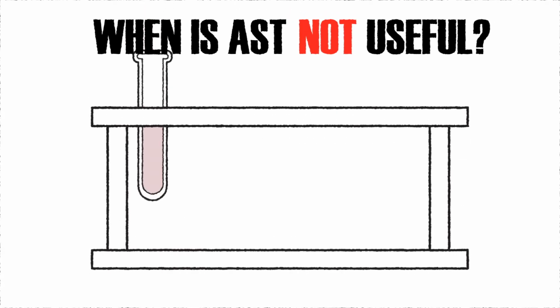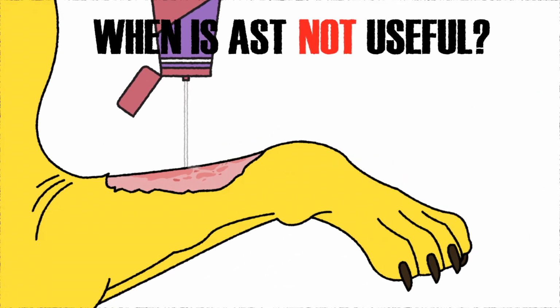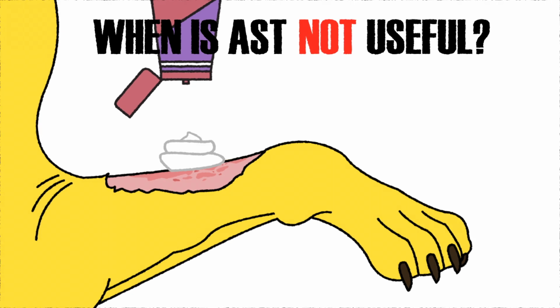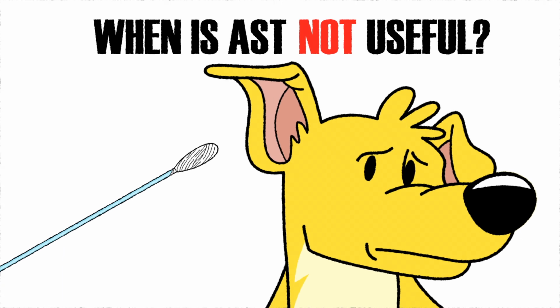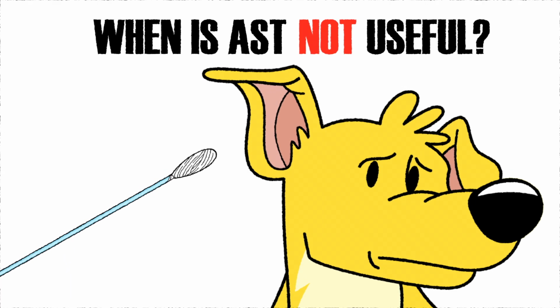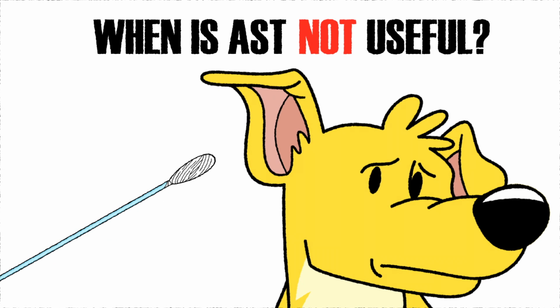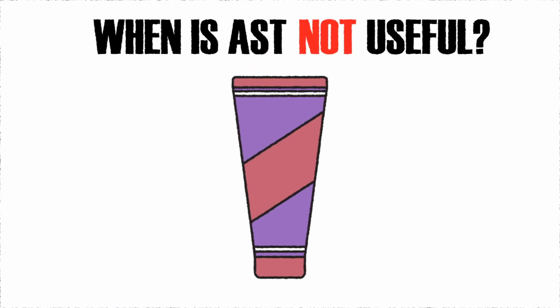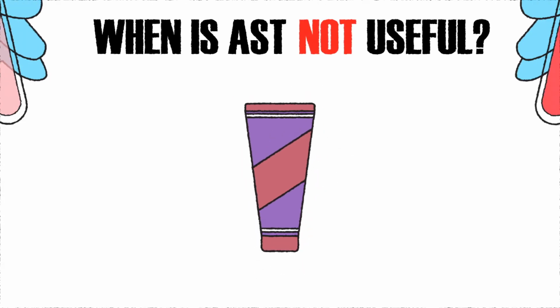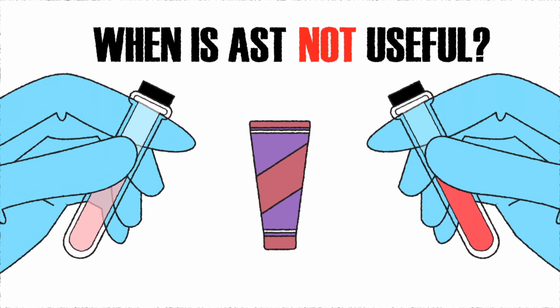This is because AST is based on concentrations of antibiotics in the plasma, while higher concentrations of drugs can occur when they are used topically. For example, Pseudomonas aeruginosa cultured from the ear canal might be resistant to an antibiotic on an AST panel, but the concentration of antibiotic with topical application far exceeds the highest concentration of antibiotic tested on the AST. This means that AST panels can't predict whether a topical antibiotic will be able to treat the infection. Sometimes high concentrations of antibiotics in topical preparations can overcome the resistance seen at lower systemic antibiotic concentrations.